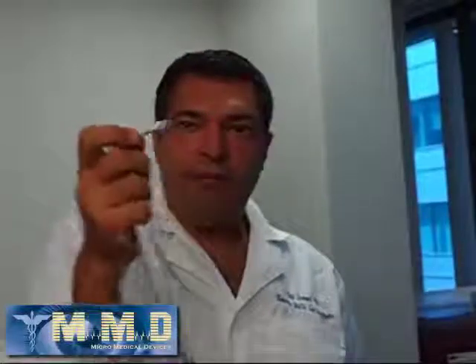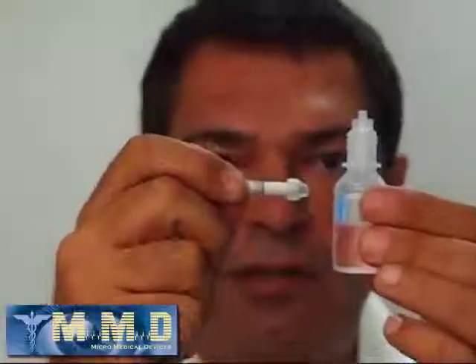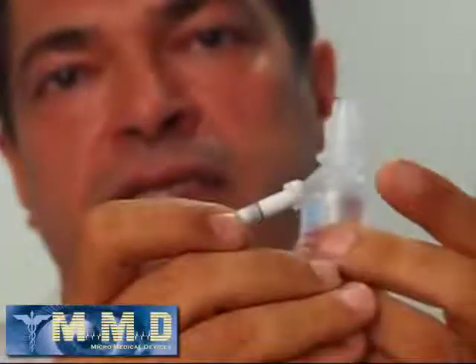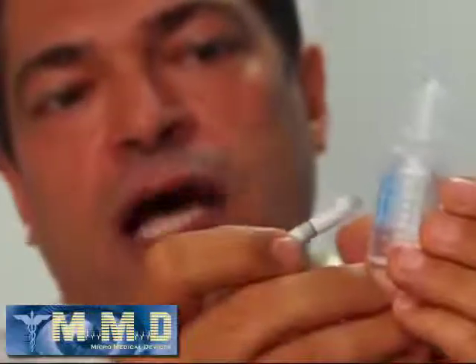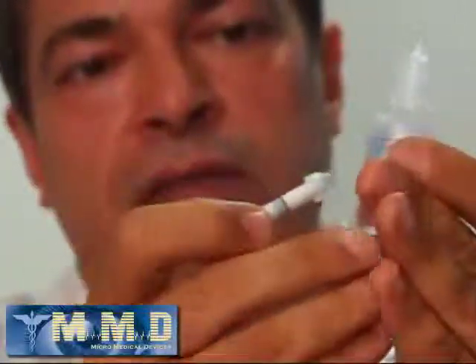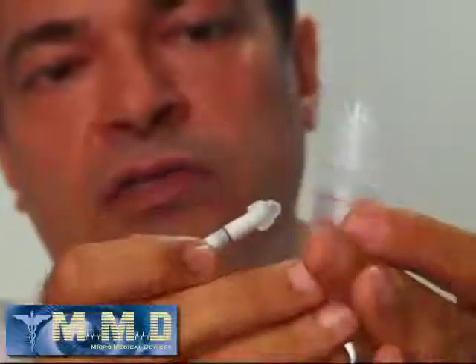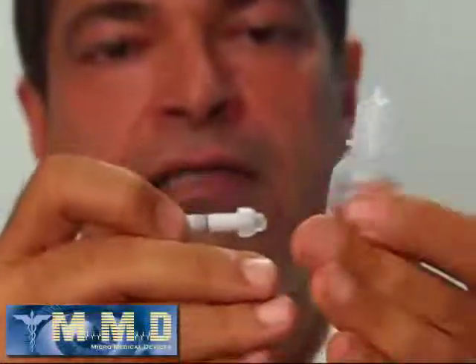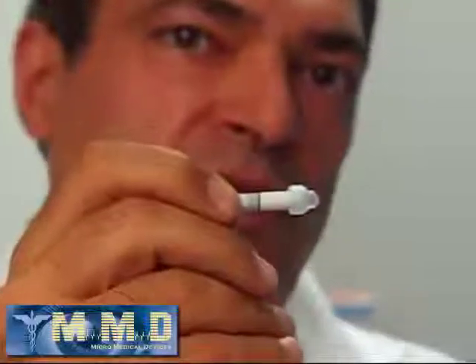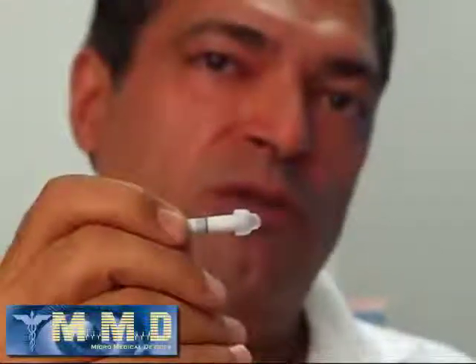Next, you want to make sure that when you approach the cornea, you approach it straight on. The patient does not have to be tilted back in this particular scanning apparatus, but what you don't want to do is press too hard on the eye, or approach in an angle that causes the meniscus to be drained completely. So if you touch the eye like so, in an oblique angle instead of perpendicular angle, you make an avenue for the water to seep out instead of stay inside the container. So just approach the eye straight, and once the tip touches the eye, do not force into the eye, just hold it on the eye and instruct the patient to look at the blinking light.